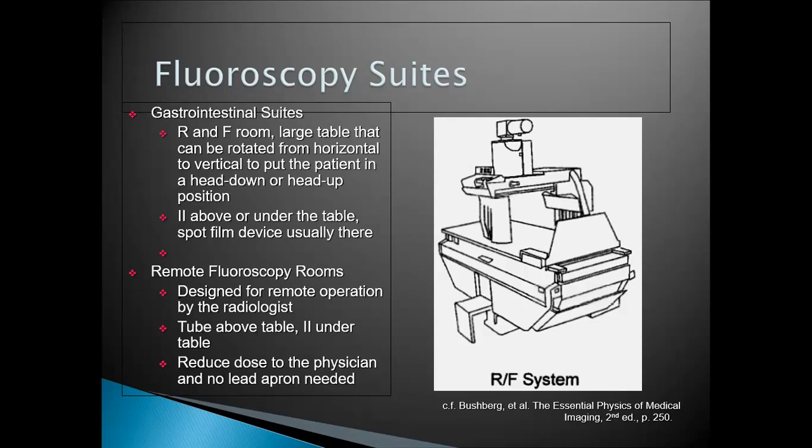If it were possible, a fluoroscopy intervention to be done from remote rooms would be very nice and good. But in most cases it's not always possible.